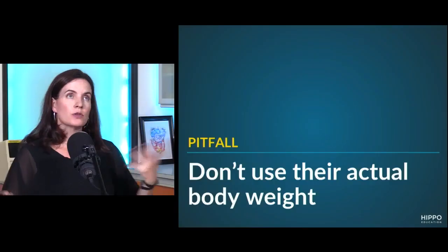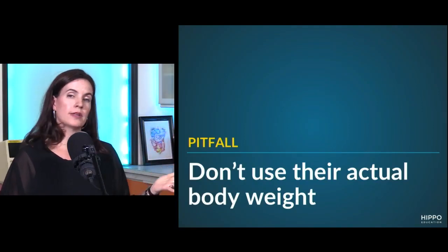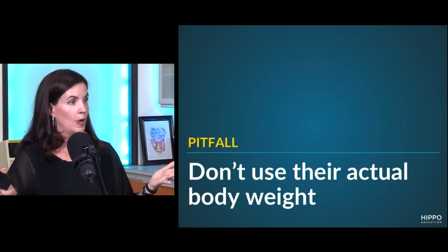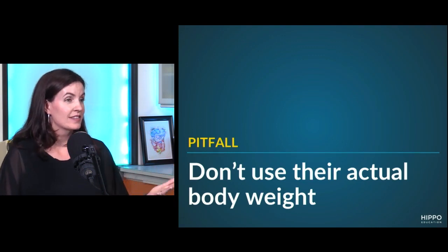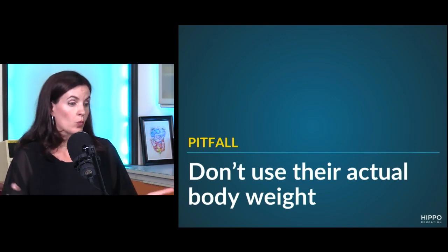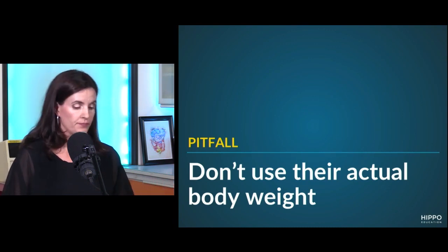And to give you an impression of that, say we're ventilating Paul. I'm going to say Paul's 70 kilos. I don't know what he really weighs, but that might be his 68. 68. Pretty close. 68 makes the math really hard for me, so could I go with 70? Yes, absolutely. And so I'm going 6 cc's per kilo. So his tidal volume is going to be around 420 cc's in each breath. And that would be a reasonable starting ballpark for the average 70 kilo person. Got it. The ideal body weight for my height and my gender.